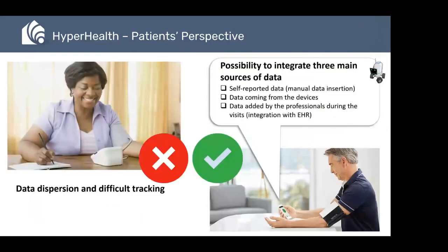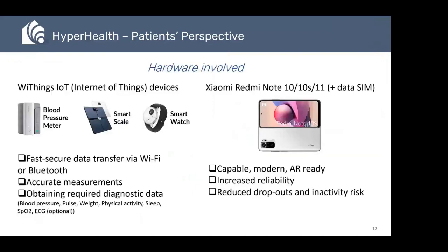This paradigm has been considered the most viable to make sure that the patient can self-report both manually and automatically their data, both from the devices, but also from other data sources that are available and that we will explain later on when we speak about the clinical platform.